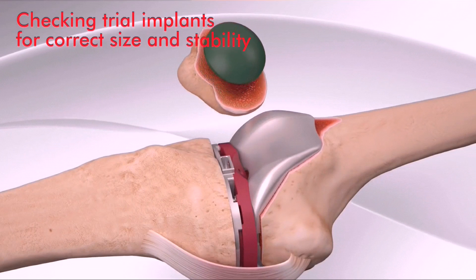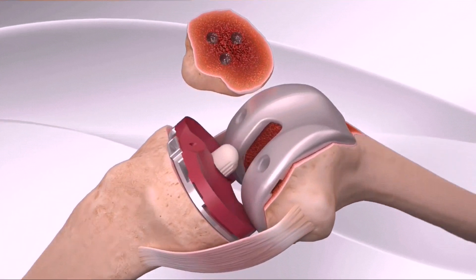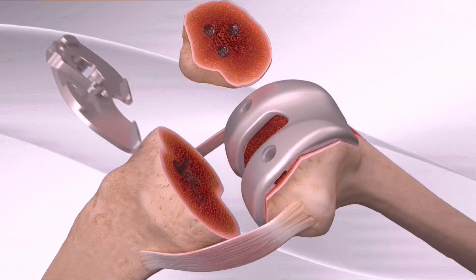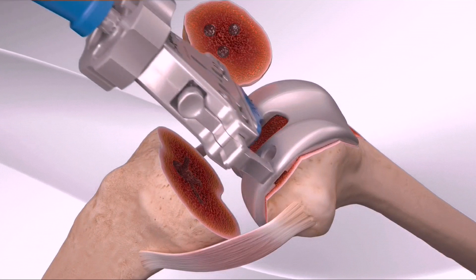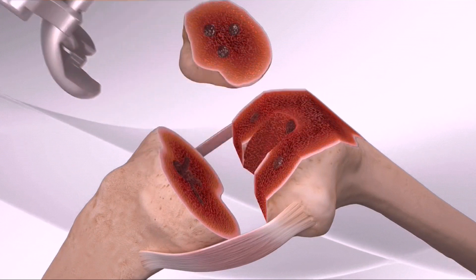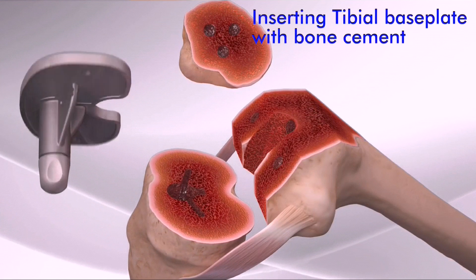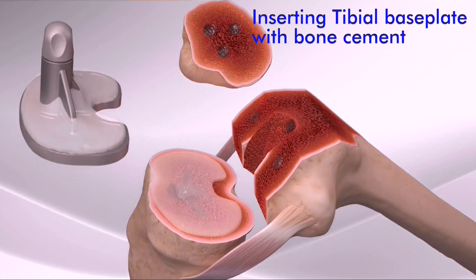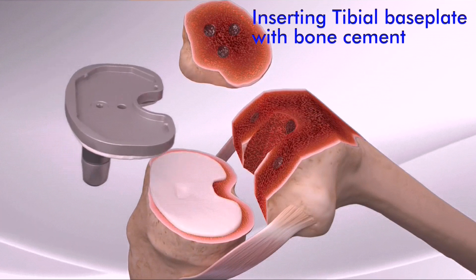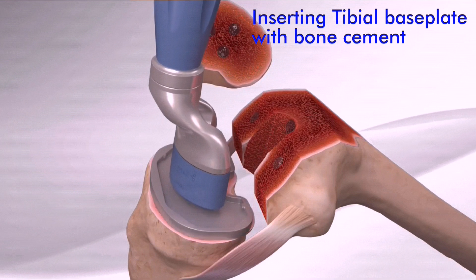The trial implants are then removed and the surfaces are prepared for placement of the final implants. Your doctor applies bone cement on the backs of the tibia, femur, and patella implants for final fixation.